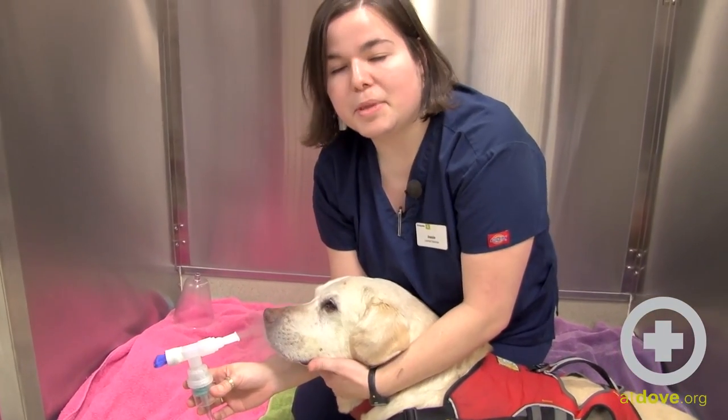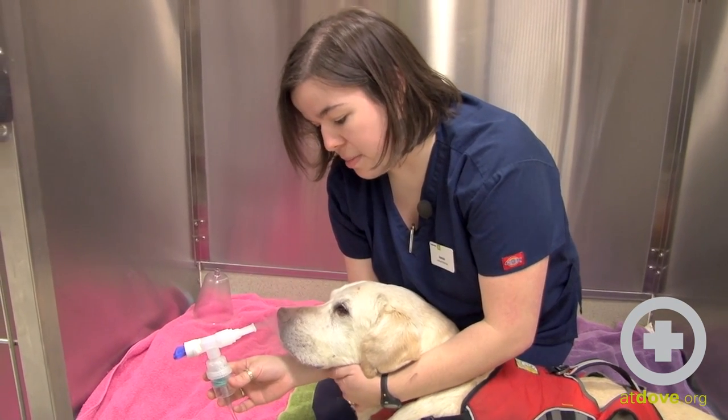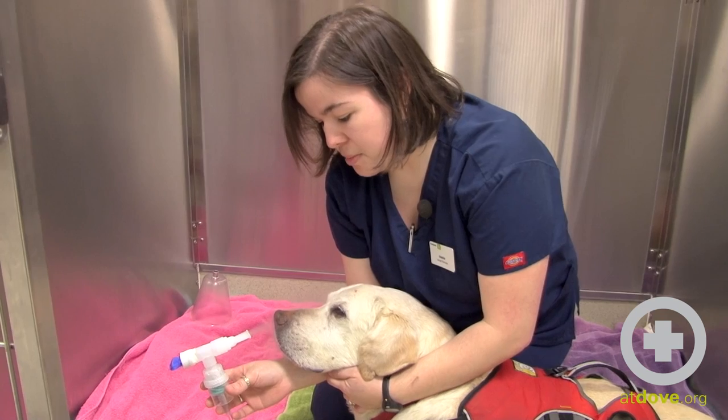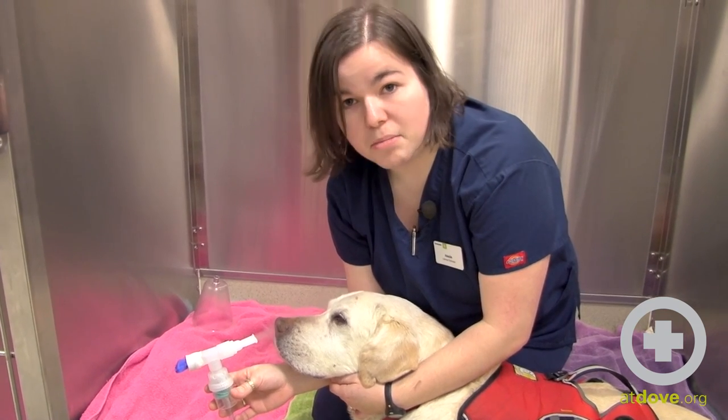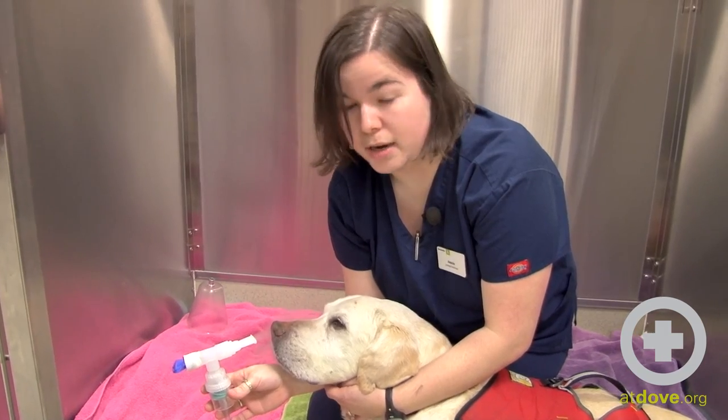We try to keep the patient as sternal as possible, keep them in a comfortable position while we nebulize them. We want them to breathe in this mist for about five to ten minutes to help thin out as much of those secretions as we can and give them the best opportunity to get them out.